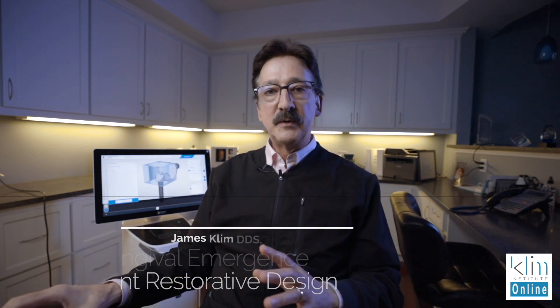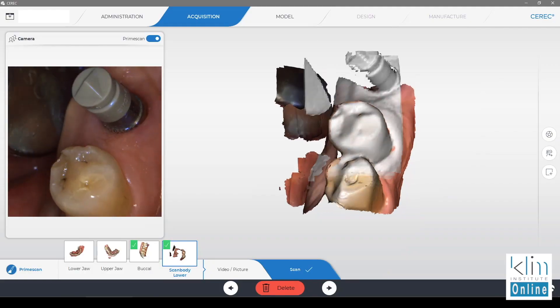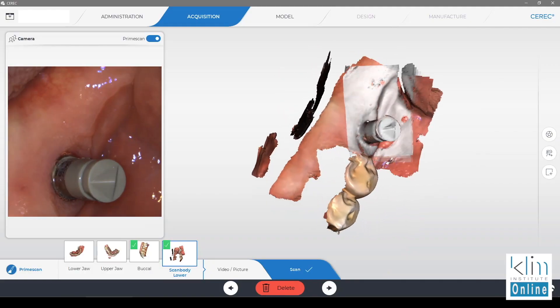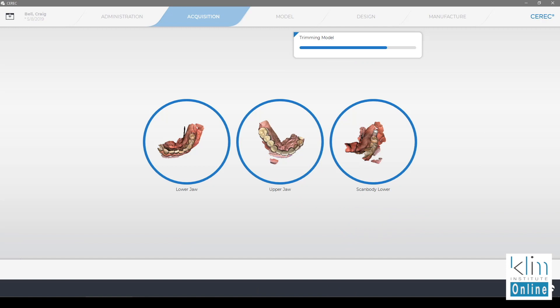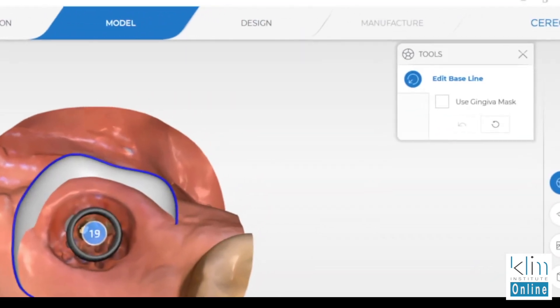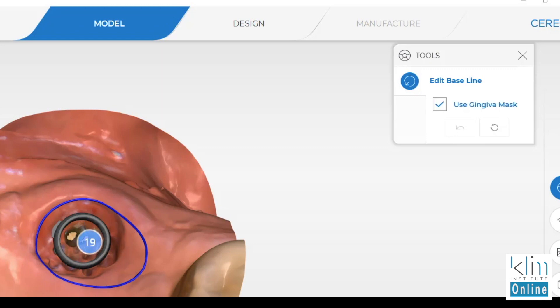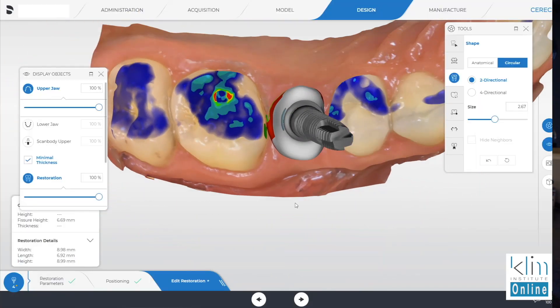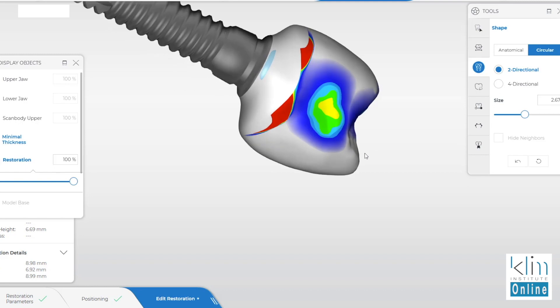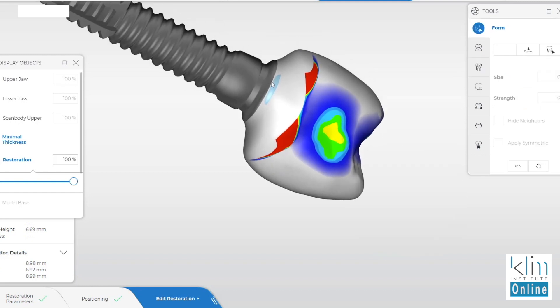There's two ways to do it — either a one-piece or a two-piece. Quite often I'm using two-piece when I'm in my aesthetic theater. One thing we have to deal with, particularly with the flow of the software, is once you do your scan post-scans and render into your model screen, the first screen that shows up is the gingival mask option. When do we use the gingival mask option? Because that forms the sub-gingival emergence relative to how the tissue is scanned into the quadrant — or we're not going to use the gingival mask, which will give you a more generic emergence, which can actually work better most of the time if you have a thick tissue biotype.